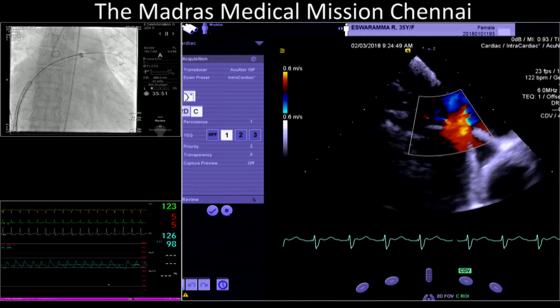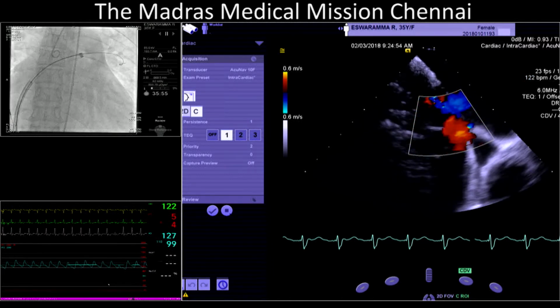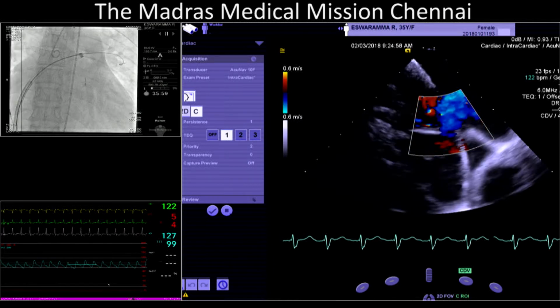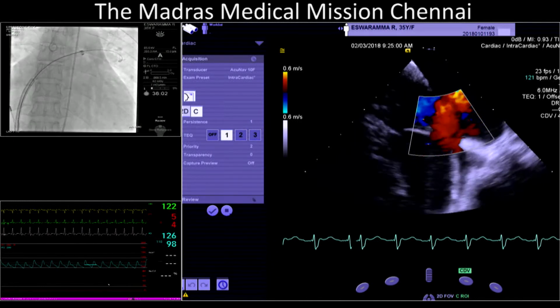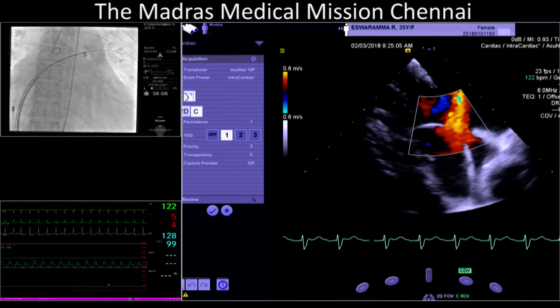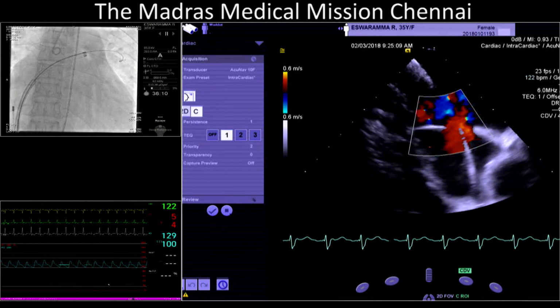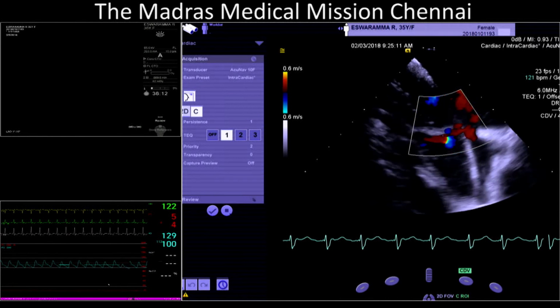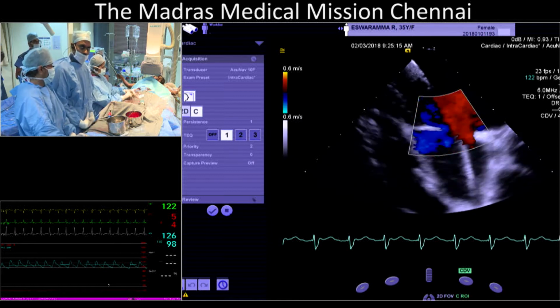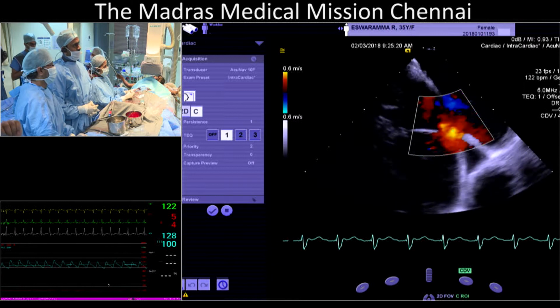Okay. Shiva, is the patient in sinus rhythm or has some form of atrial tachycardia? The patient had an atrial flutter, and we gave metoprolol, and right now is on a 2:1 AV nodal block. Currently, we are giving amiodarone as an infusion to achieve a medical cardioversion of this flutter. She was in sinus rhythm. But if it doesn't get... I will cardiovert. Would you not want to convert this rhythm?